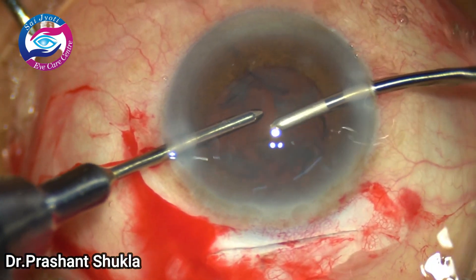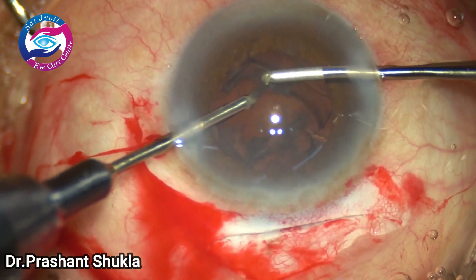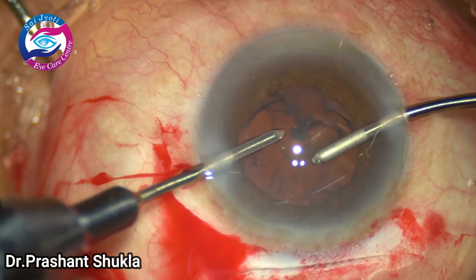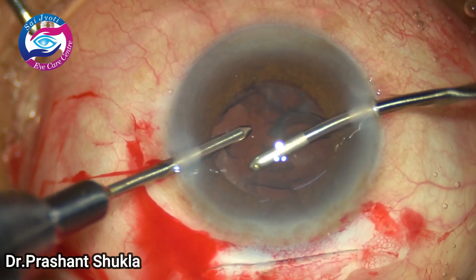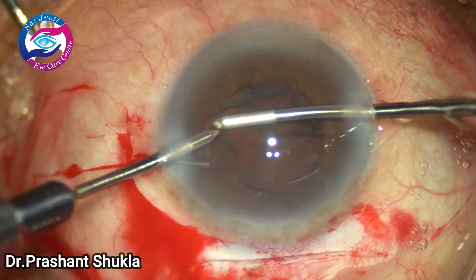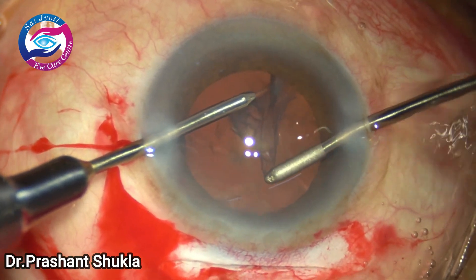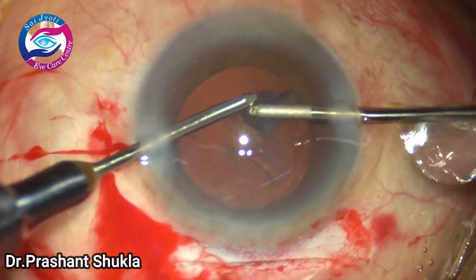Here I am using bimanual irrigation-aspiration with a vacuum of 350 mmHg to remove all the cortical matter in the capsular bag. This was a diabetic brunescent cataract and the cortex is also very sticky, so it is taking some time to remove. I am now removing the sub-incisional cortex. Hands are switched and we are towards the end of cortex removal. This video has been edited and only the important aspects have been retained.